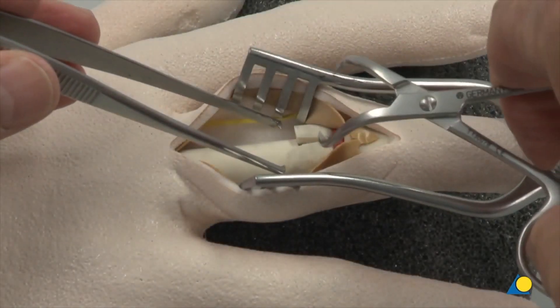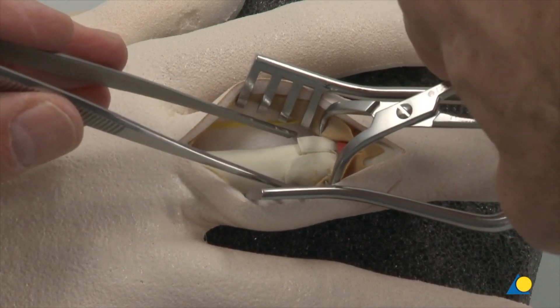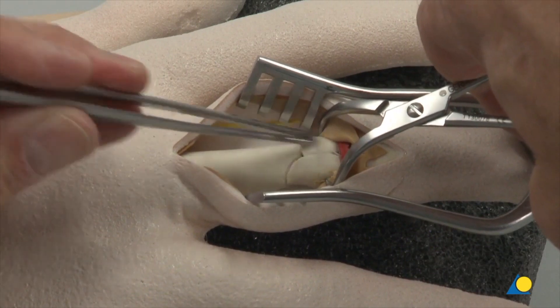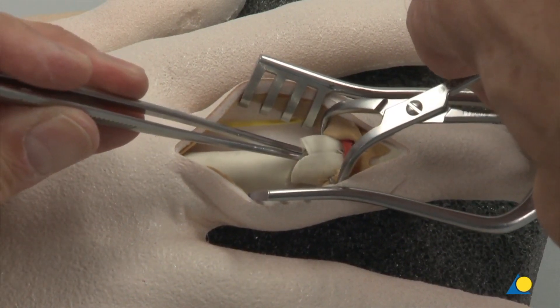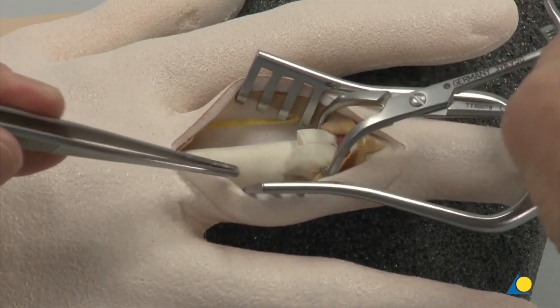The two articular fragments are accurately reduced and held with the small pointed reduction forceps. In a clinical situation, correct articular reduction is checked using image intensification and by direct visualisation.